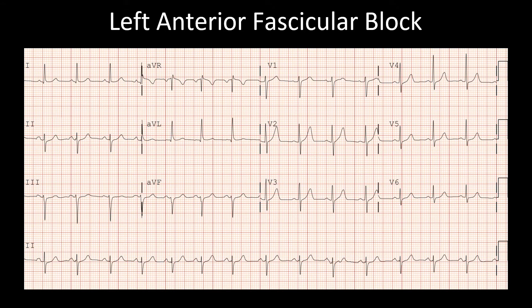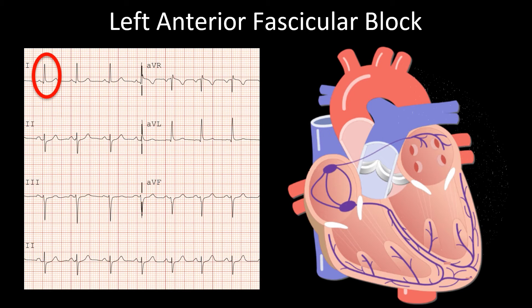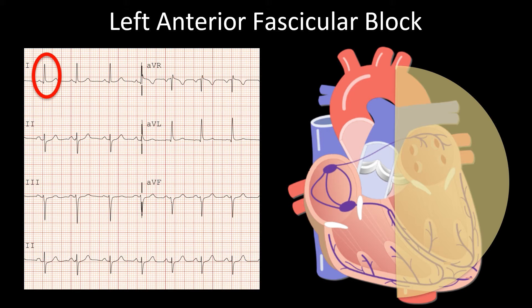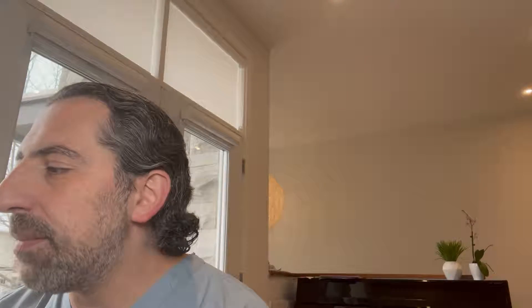This is an example of left anterior fascicle block. As you can see, lead 1 is positive and lead 2 is negative, indicating left axis deviation. When lead 1 is positive, the depolarization vector points to the left side of the heart, and when lead 2 is negative, the axis of depolarization points towards the top right. The overlap between both is minus 30 to minus 90 degrees, and hence the axis is shifted leftwards.